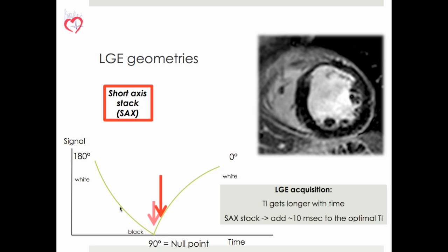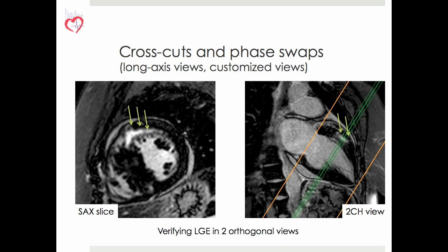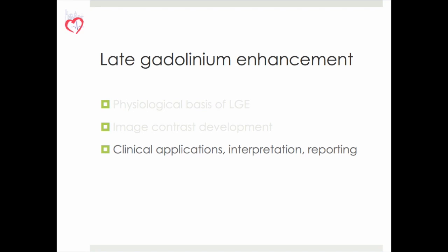away from it. Important point in acquisition of late gadolinium enhancement is that we verify bright areas in two orthogonal views. And finally, clinical applications.